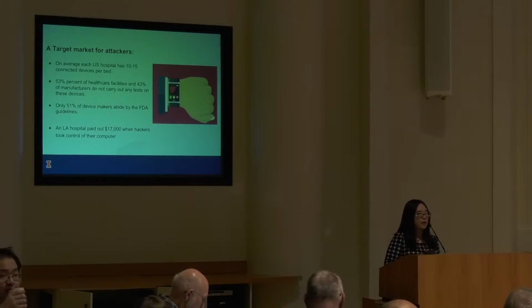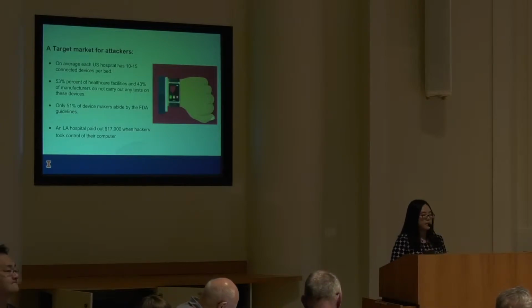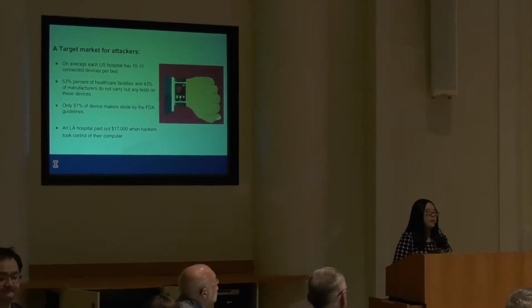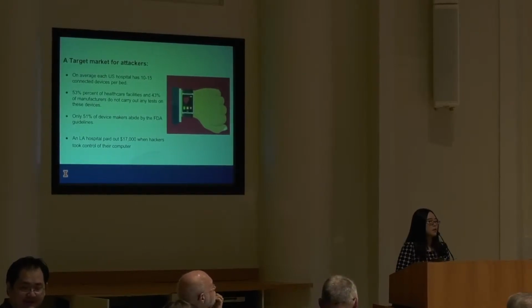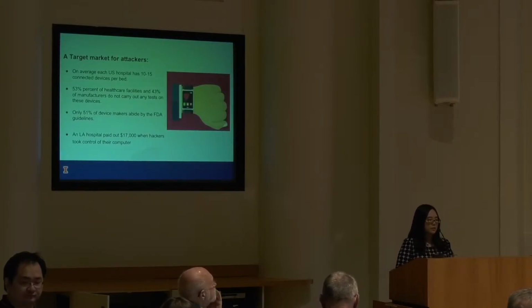Moreover, these devices are not well defended against potential attacks. According to a study, 53% of healthcare facilities and 43% of manufacturers do not carry out any tests on their devices, and only 51% of device makers abide by the FDA guidelines. Even more serious is the consequence when medical devices are attacked. This brings huge profits to attackers. For example, an LA hospital paid out $17,000 when hackers took control of their computer.